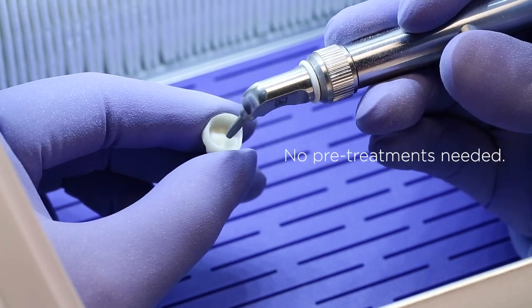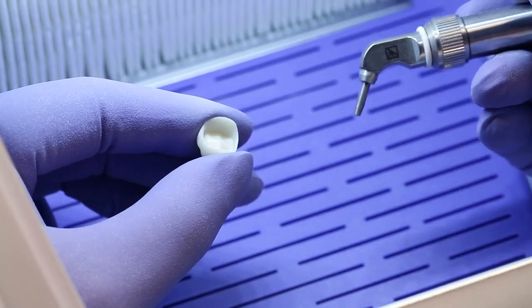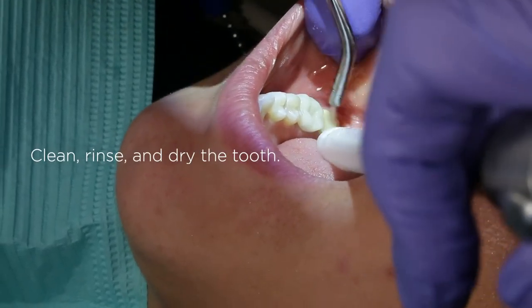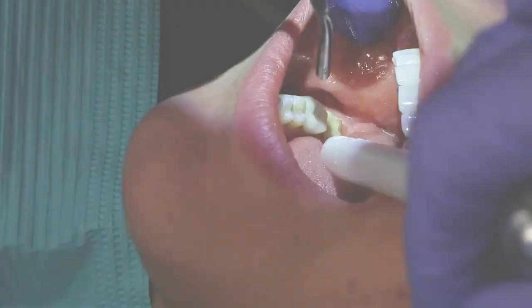Do not apply anything to the sandblasted surface, as this would interfere with cement bonding to the zirconia surface. To prepare the tooth for final crown seating, clean, rinse, and dry the tooth. Do not desiccate it, but rather leave the surface evenly glistening with moisture.